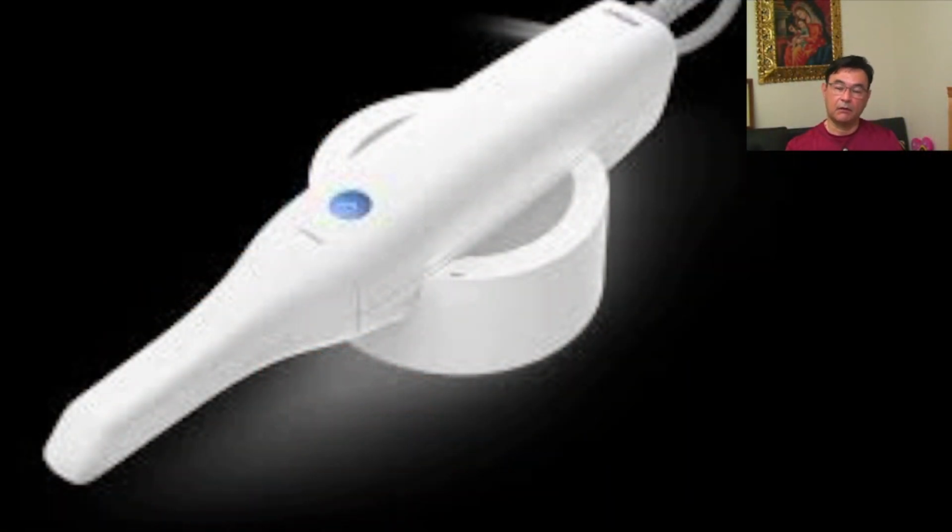I want to show you the picture of that. Probably some of you have seen it before in the office. In any case, that's the Medit 500, one of the best scanners on the market. And as I said before, we use that to get the impressions now.